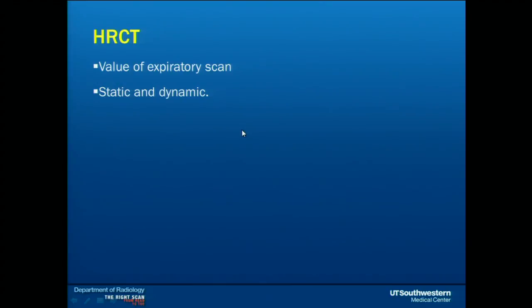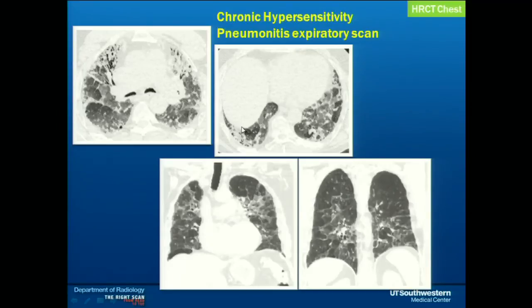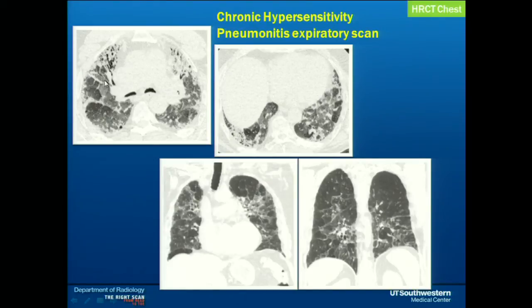We also do expiratory scans — static and dynamic. This particular patient had a parakeet for 15 years and developed chronic dyspnea and cough for the past six months. The chest CT scan was very remarkable. You can see this is the expiratory scan: there is posterior bowing of the trachea showing very low attenuation areas, which are areas of air trapping. In addition, you can see upper lobe fibrotic changes. This constellation of findings was highly suggestive of chronic hypersensitivity pneumonitis in a patient with positive exposure. This scan helped in making the diagnosis without the use of biopsy.